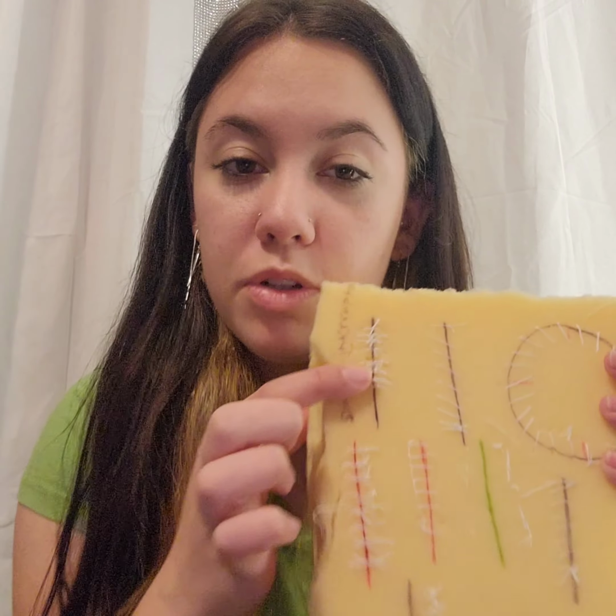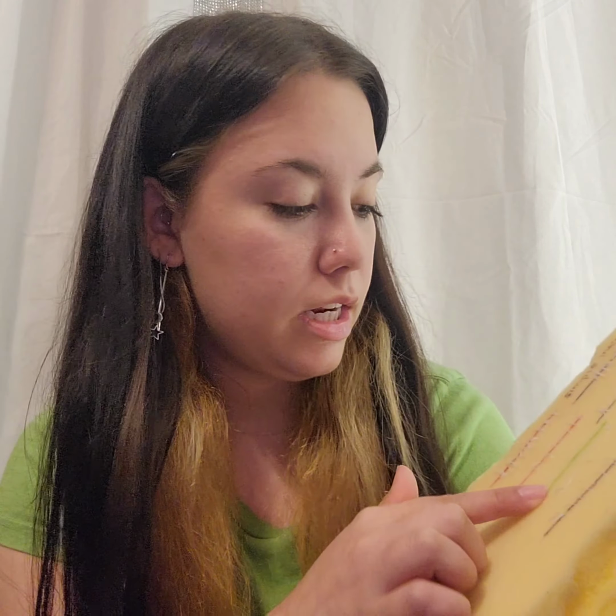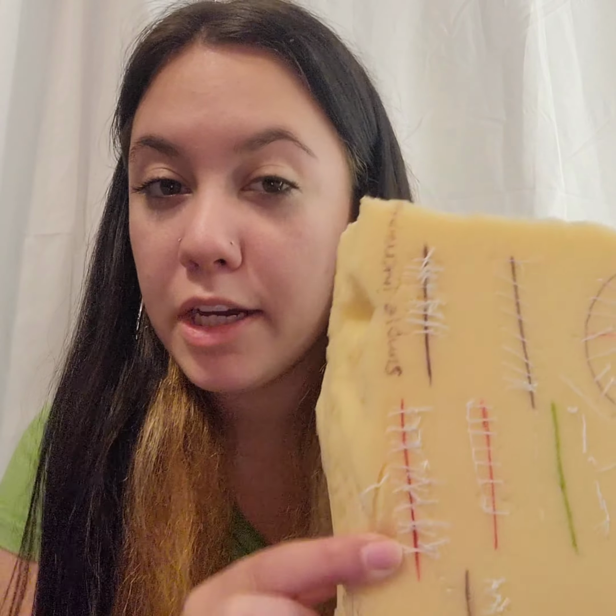Either way, I hope you guys liked my video and learned something new. And again, just a refresher of the sutures I did: I did a simple interrupted, I did the horizontal mattress, and then I did the cruciate, which is one of my favorite ones just because I think it looks really cool in my opinion. I have job shadowed a few veterinarian practices and done internships, and I commonly see them do simple interrupted, which I thought was weird because there are all the other ones, but I guess that's just what they have to do.